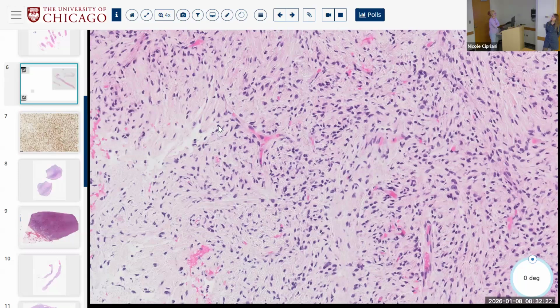You mentioned CD34, but you didn't mention the tumor. Arguably it's less on the differential here, but what soft tissue tumors are CD34 strongly positive? DFSP and SFT, right? Dermatofibrosarcoma protuberans and solitary fibrous tumor, CD34 would help you with. Does this have morphologic features of either of those? Not really.